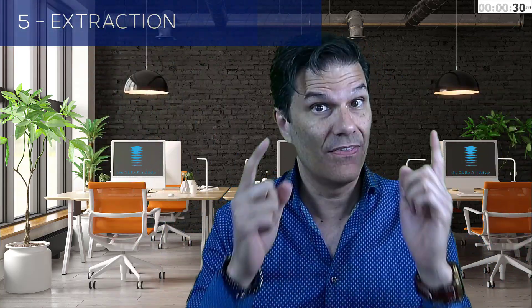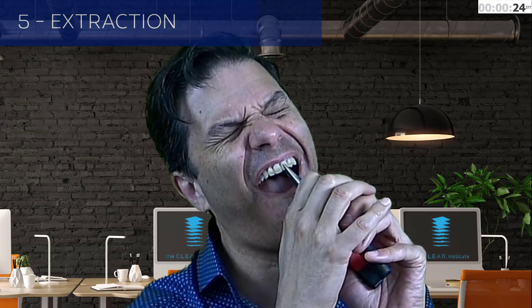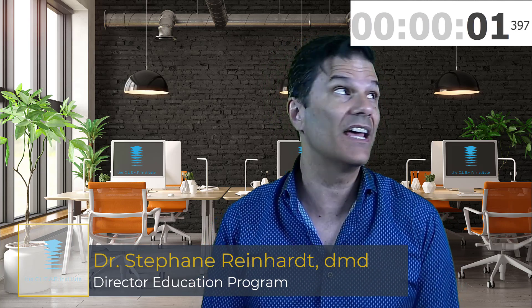Number five: extraction. Never my first choice, but sometimes a dentist's gotta do what a dentist's gotta do. A lot of space can be created using these five methods. Doing so can completely change the aesthetics and function of your patient's occlusion — because it's not only about the look, but about how you can improve your patient's overall health and quality of life. My name is Stefan Reinhardt, Director of Education for the Clear Institute.